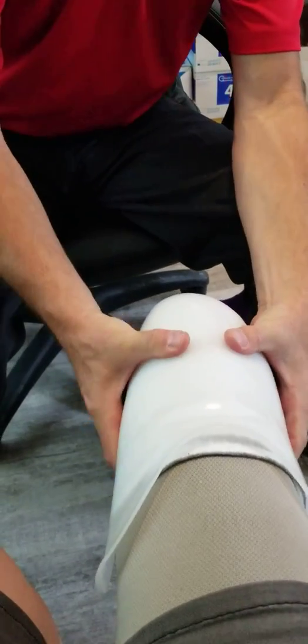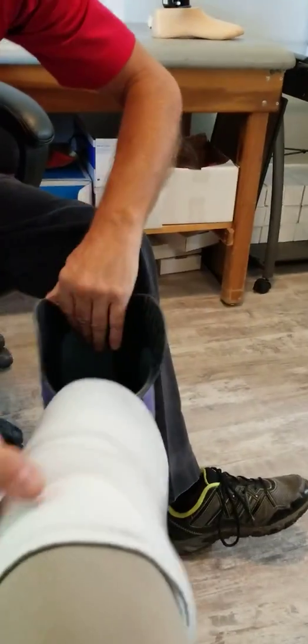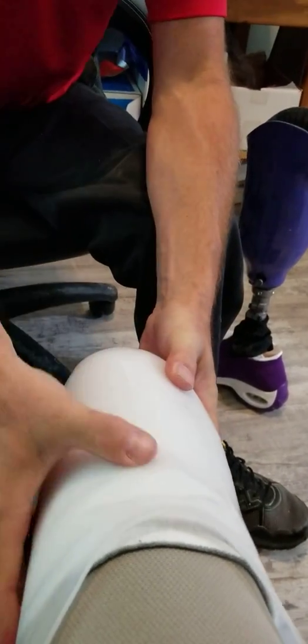Especially with the preparatory leg — the first leg — the limb is going to shrink. You want to be able to adjust it, see it, and make it as easy and as best as possible. For example, I can slide this flexible inner liner, I can squeeze in areas, and I can see where the gapping is. If I were to just put the prosthetic leg on, how am I going to judge as a prosthetist where the gapping is and make an accurate adjustment? But with this, I can pull it in, I can line it up, I can make sure everything's lined up, and I can feel where the gapping is.